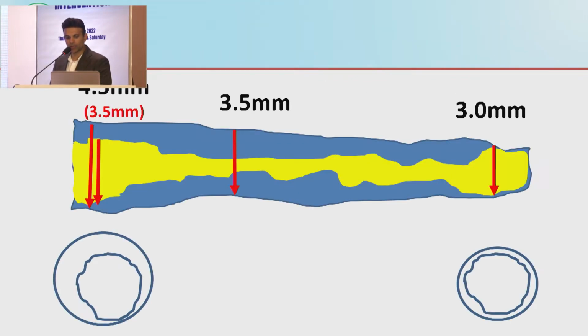Let's talk about unhealthy proximal landing zone. So this is fun now. Nobody likes these, right? And this is the same principle. So just in the interest of time, I won't belabor all of this, but you've identified all of the things that you need to identify by doing an IVUS. You know what the plaque composition is, so you'll treat that appropriately. That's a separate section of discussion based on the IVUS findings.